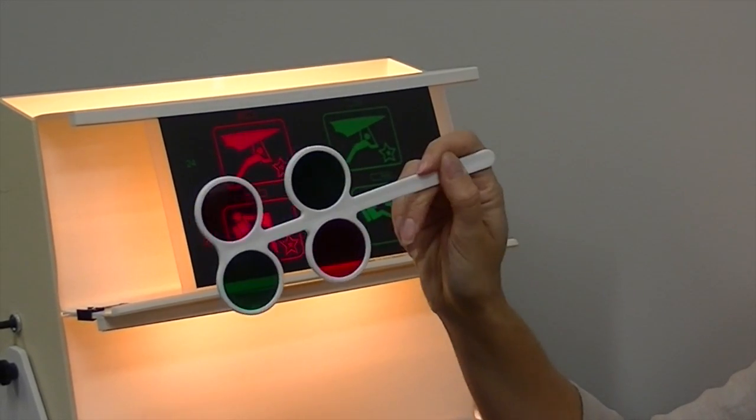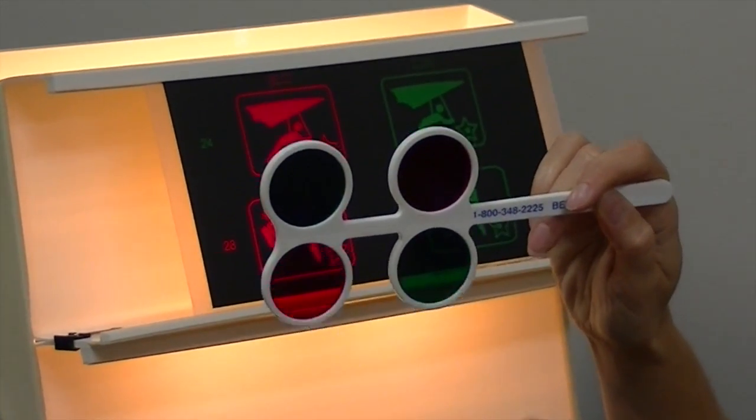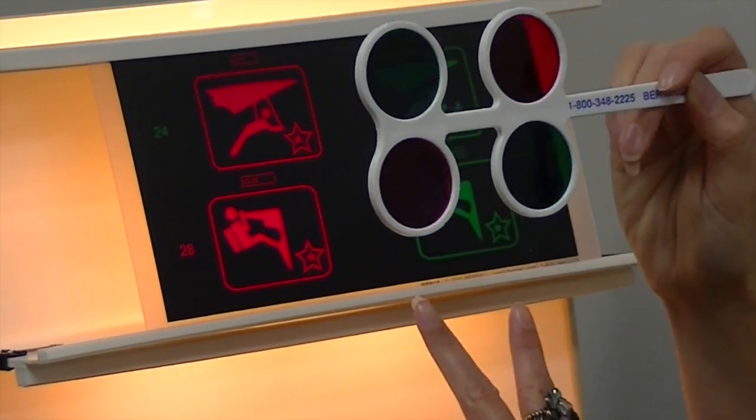What that does is one side causes us to converge or cross our eyes, the other one causes us to diverge our eyes in order to see this image as a single image.